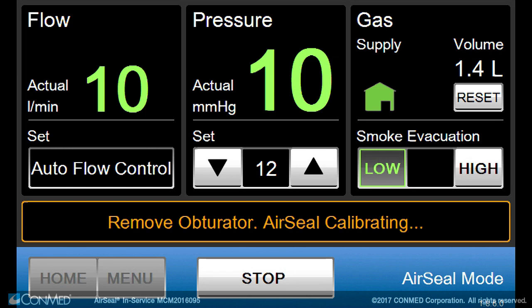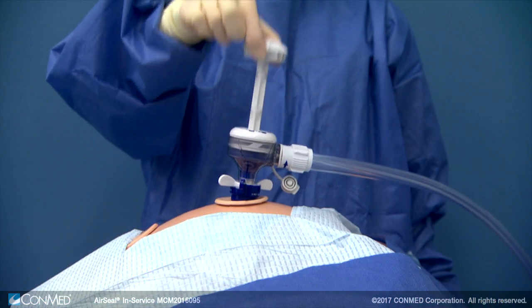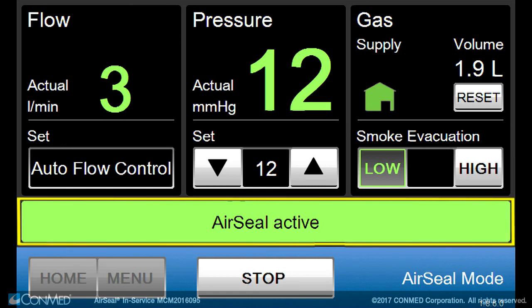Remove the obturator when prompted and wait for the 8 to 15 second calibration cycle to complete prior to inserting any instruments or scope through the air seal port or inserting any additional trocars into the abdomen. Once complete, an audible tone will sound, alerting the user that air seal mode is active and ready for use, and a green bar will appear on the IFS screen showing air seal active.